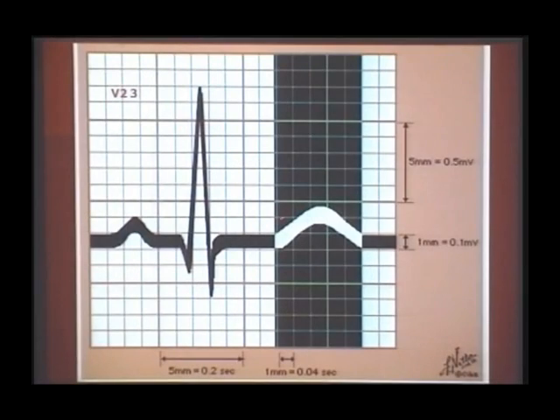Whenever your T wave is not satisfying these 2 points, either it is not going in direction with the QRS, or the amplitude is bigger or smaller than the QRS, it is abnormal. So the T wave represents ventricular repolarization. Whenever the QRS is upright, the T wave is upright. It is measured in V2 and V3, where the T wave is nicely seen; you have to measure the amplitude. There is no duration of the T wave.